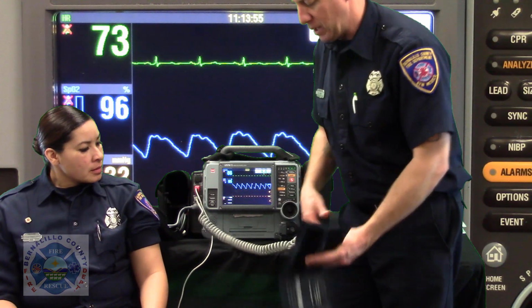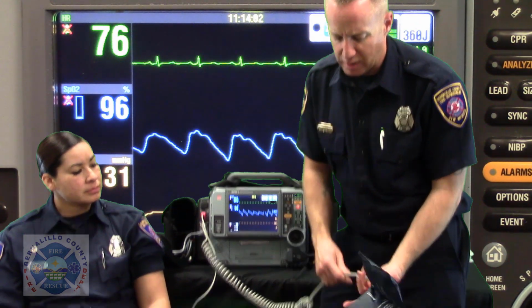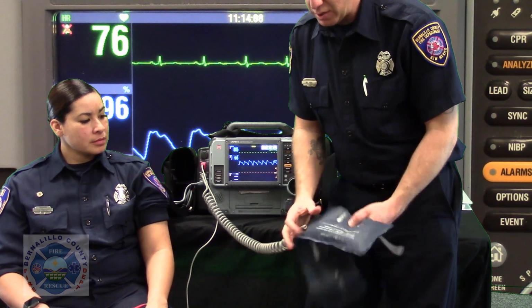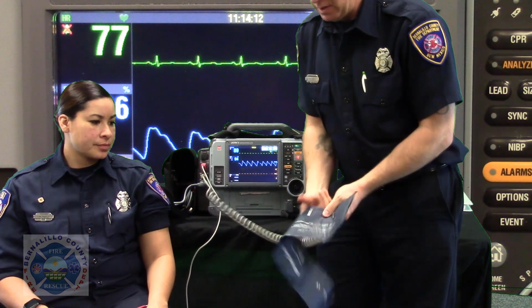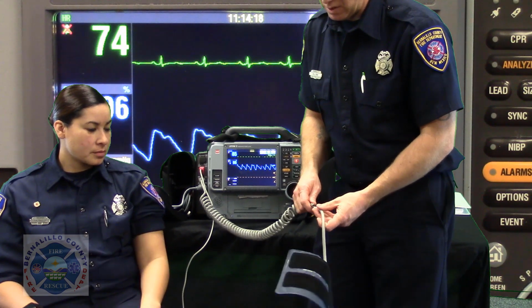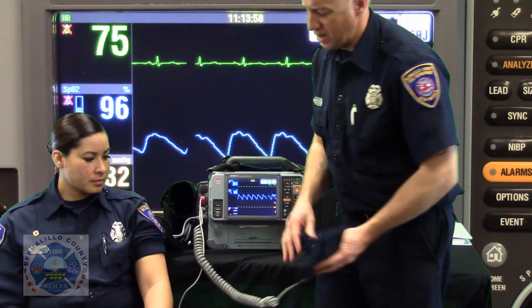Let's say that you're operating your blood pressure cuff and it's not working, and you're trying to troubleshoot what's going on, and you have some residual air left in the cuff. Well, it's just a quick motion to unhook it. You're going to want to deflate all the air back out of the cuff, get it nice and flat again. Make sure that it's the correct size. Make an adjustment if the patient's larger or smaller, and then replace the cuff and try it from there.